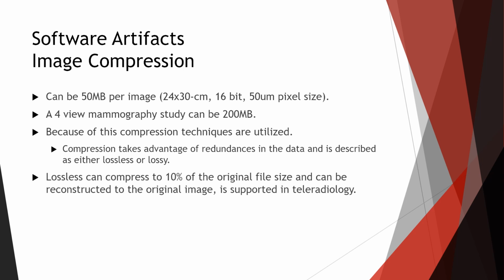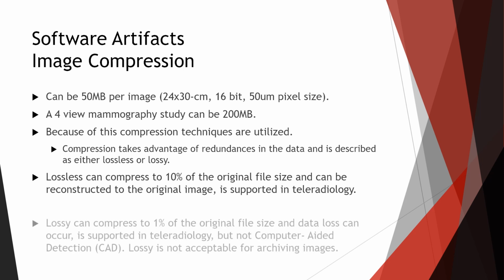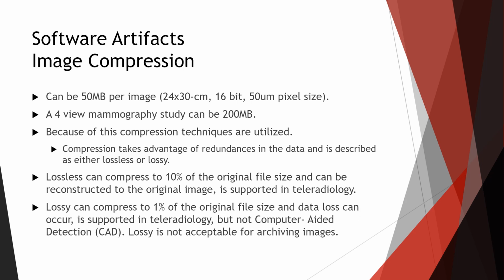Lossless can compress to 10% of the original size, so we can go all the way down to maybe 5 megabytes on these examples, and can be reconstructed to the original image, and is supported in teleradiology. Lossy can be compressed to 1% of the original file size, and data loss can occur.